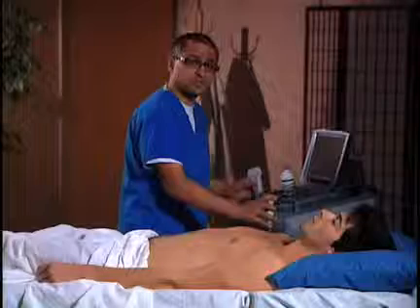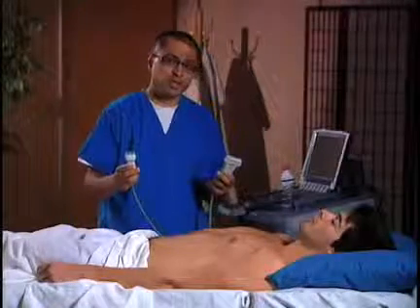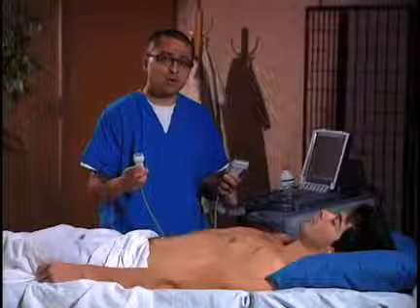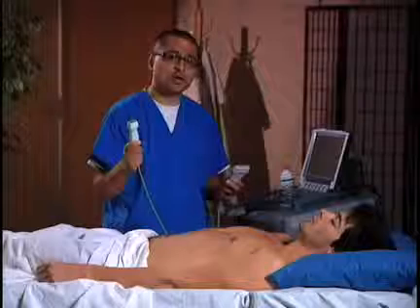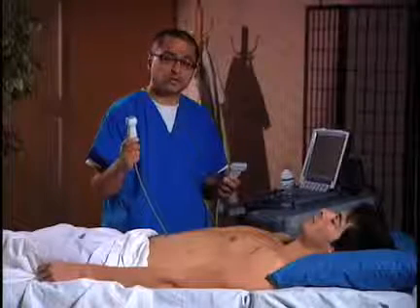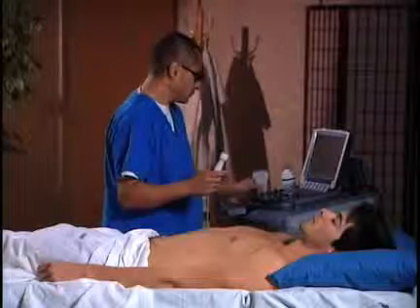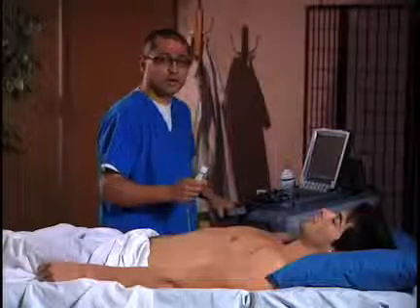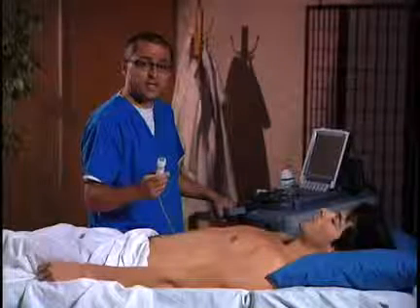We're going to start with our transducers. We have two different choices: our phased array transducer and a linear array transducer. If you're doing this as part of the FAST exam, most likely you already have a phased array transducer in your hand. Therefore, I'm going to show you what the images look like using a phased array transducer. The exam type has already been set up in an abdominal preset, and so we're ready to start scanning.